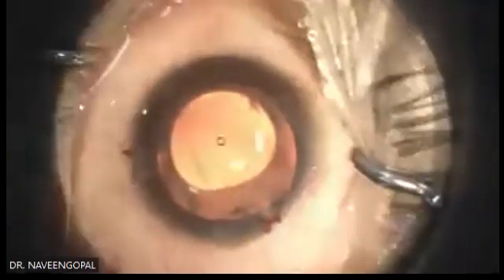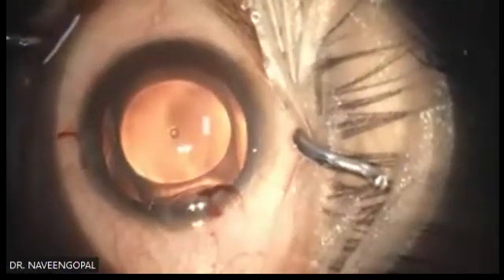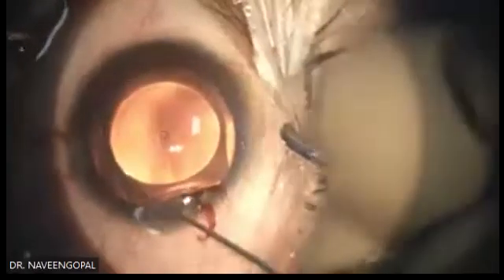I have taught myself to do that, but there's no need for you to do that. You can also always tuck it in. Now I have to tuck in only the trailing haptics.